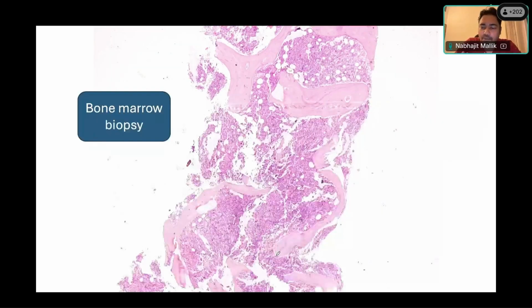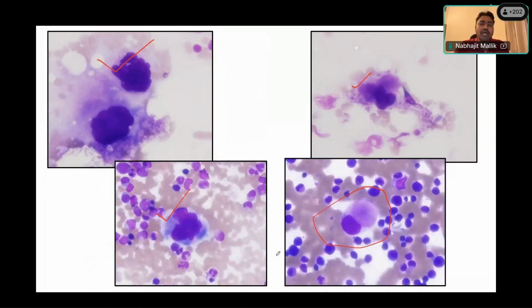So now that we have noted some hypercellularity and some pleomorphism, we go ahead and go into the bone marrow biopsy. So let me ask Jasleen here. When we have seen the bone marrow aspirate and we want to go to the bone marrow biopsy, what additional information do you want to see in the bone marrow biopsy? What is the information that you get from the bone marrow biopsy in addition to the bone marrow aspirate? Jasleen? Sir, cellularity as well as the normal positioning of the cells.